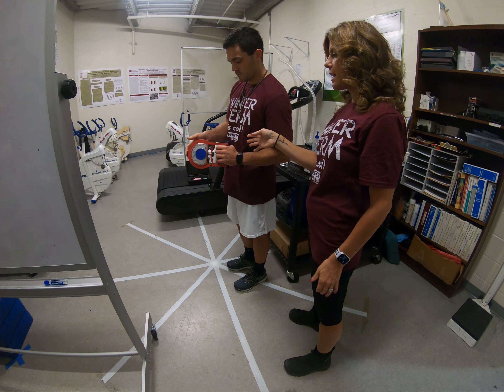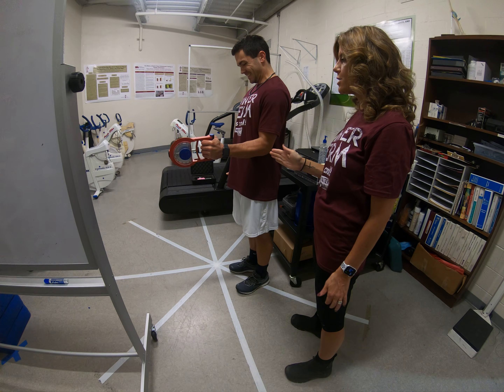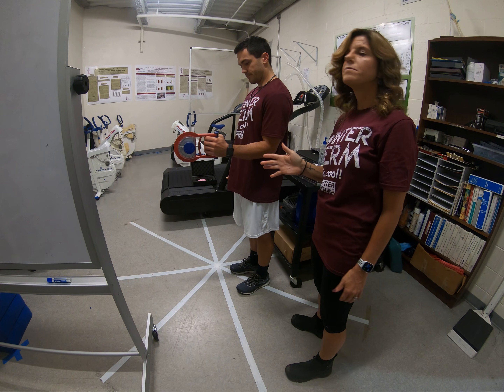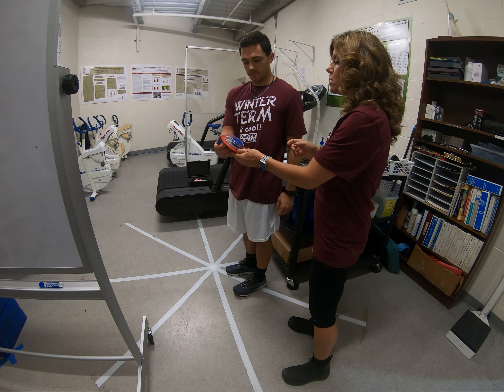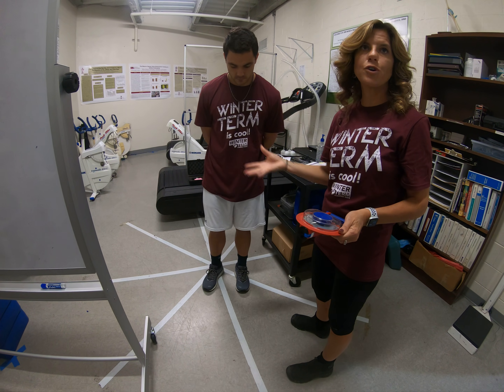This is their second time on the left arm and make sure that arm is staying at a 90 degree angle. You will write down this measurement as well and you'll do that a third time.